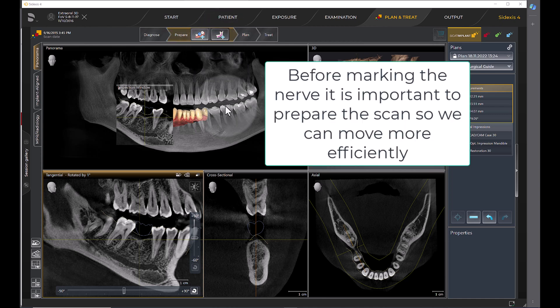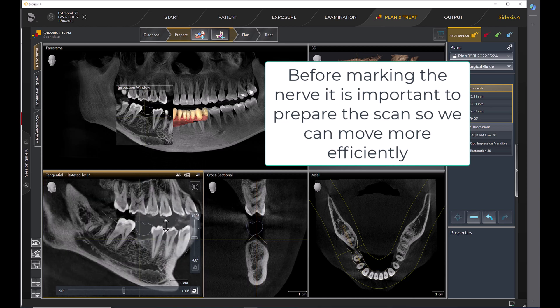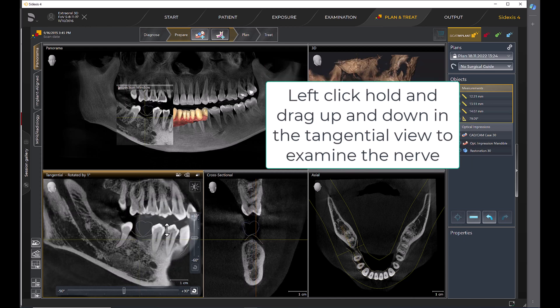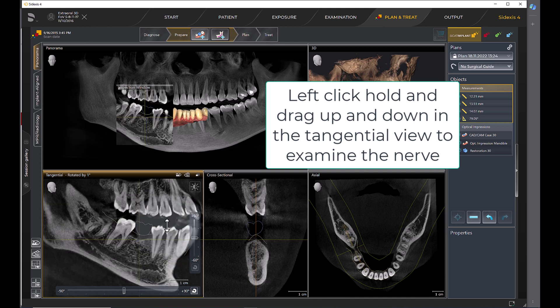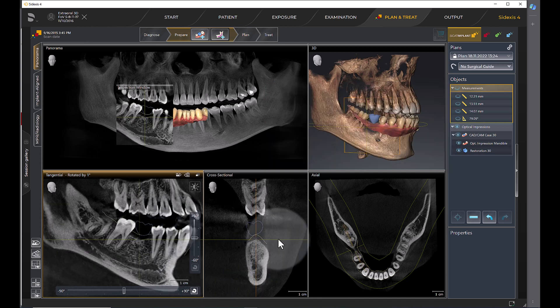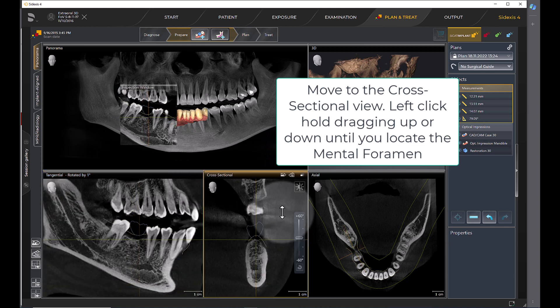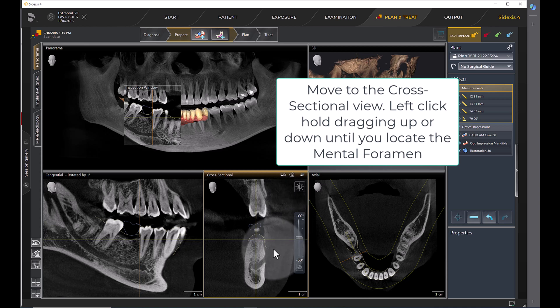Before marking the nerve, it is important to prepare the scan so we can move more efficiently. Left click hold and drag up and down in the tangential view to examine the nerve. Move to the cross-sectional view. Left click hold dragging up or down until you locate the mental foramen.